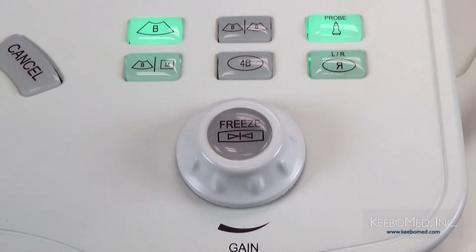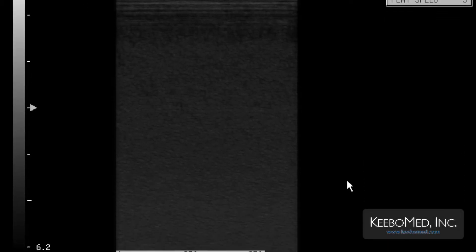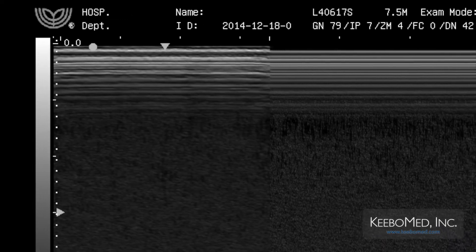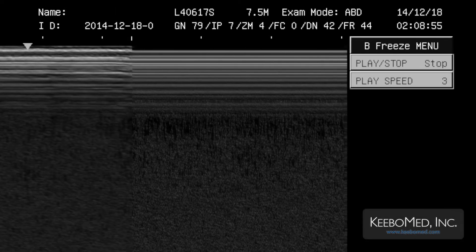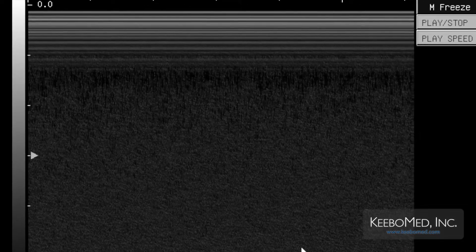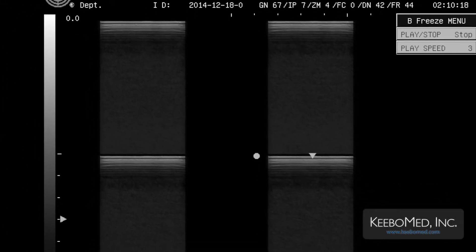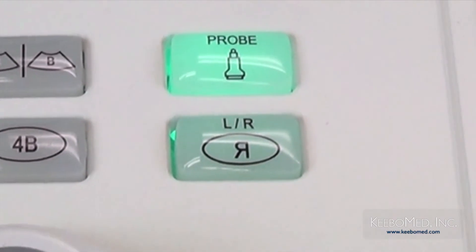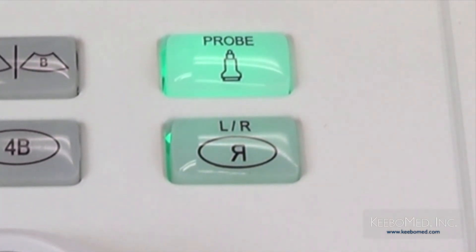On the lower right of the keyboard is another group of keys. First are the display mode keys: B mode displays a single B mode image; BB displays two single B mode images at the same time; BM displays a B mode and M mode image simultaneously. By pressing the BM key twice, the system enters M display mode. 4B displays four single B mode images at the same time. To the right of the display mode keys is the probe selection key, allowing switching between connected probes with one button. Below that is the LR key — pressing it in B mode will reverse the image left to right, and pressing shift plus LR will reverse the image up to down.